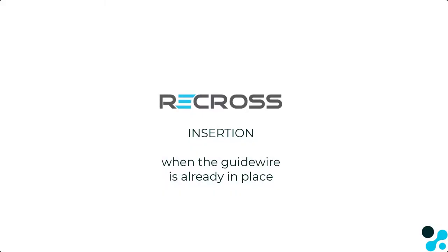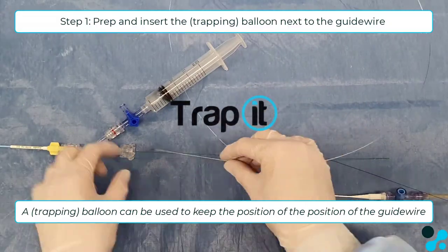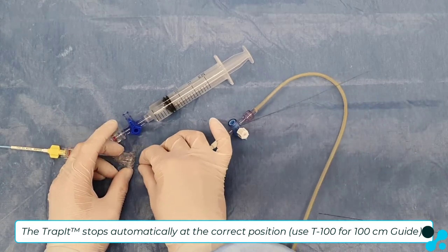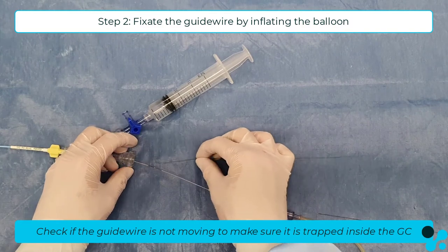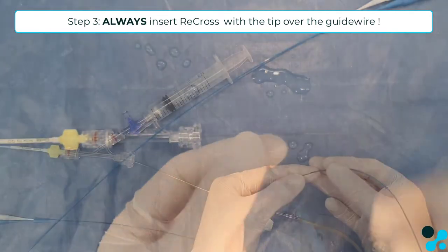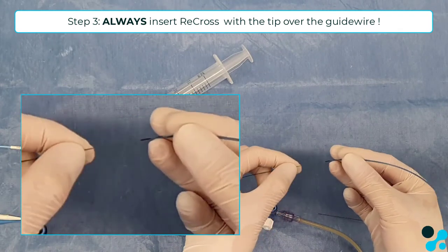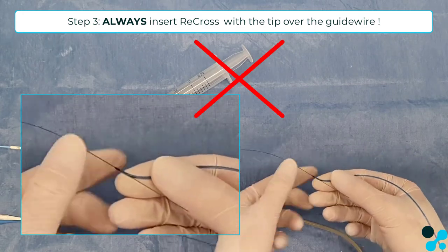When the guide wire is already in place, it is very useful to use a trapping device, like the Trap-It, in order to keep the position of the guide wire. Bring the trapping balloon inside, inflate it, and check if the position of the guide wire is locked. Then insert the tip of the Recross over the guide wire, so the guide wire is going through the full over-the-wire lumen of Recross — the white tip lumen — and not exiting from the proximal exit port.